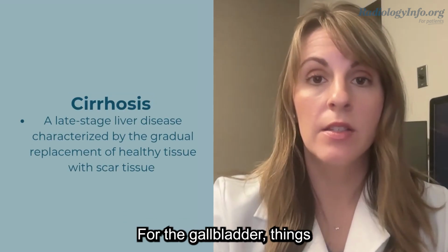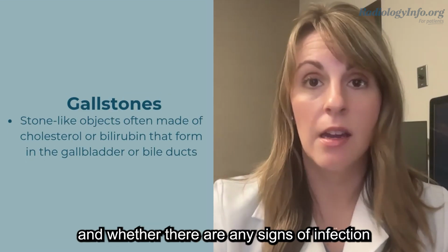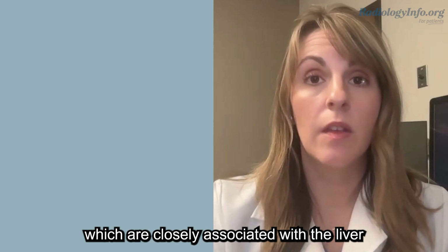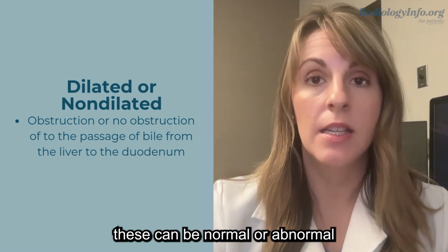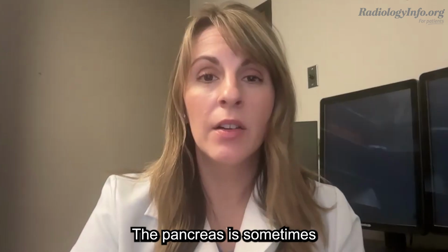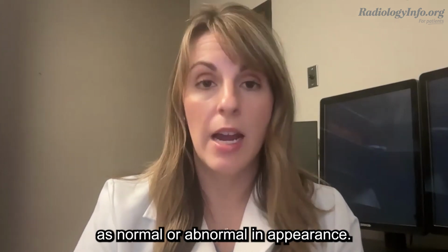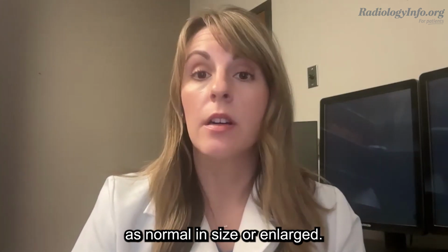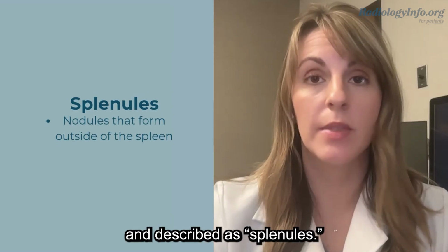For the gallbladder, things to look for include the presence or absence of gallstones and whether there are any signs of infection or inflammation. The bile ducts, which are closely associated with the liver and gallbladder, are often described as non-dilated or dilated. These can be normal or abnormal depending on your symptoms and surgical history. The pancreas is sometimes hard to see on ultrasound, and it's usually described as normal or abnormal in appearance. The spleen will be described as normal in size or enlarged. Sometimes normal extra spleen tissue will be seen and described as splenules.